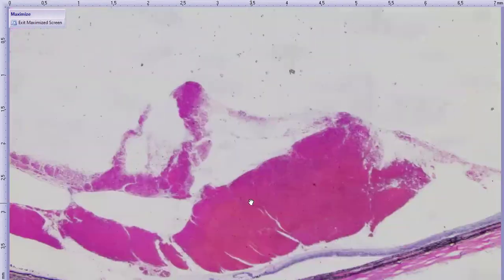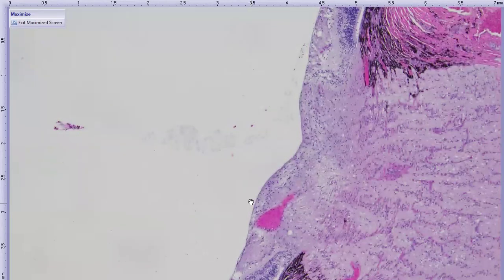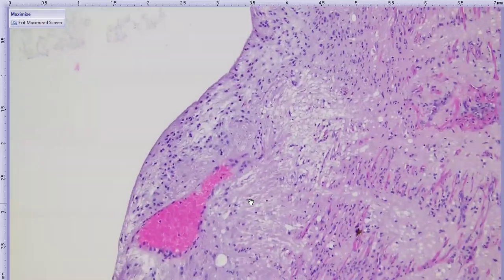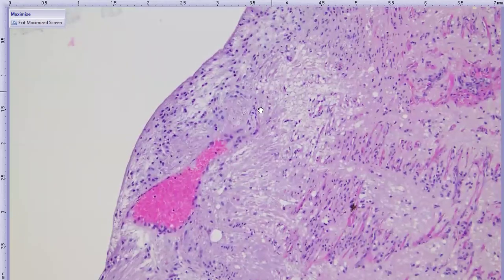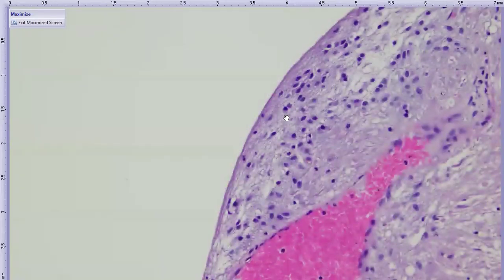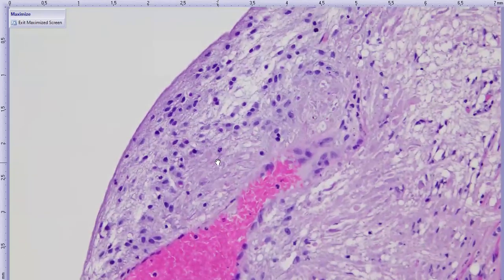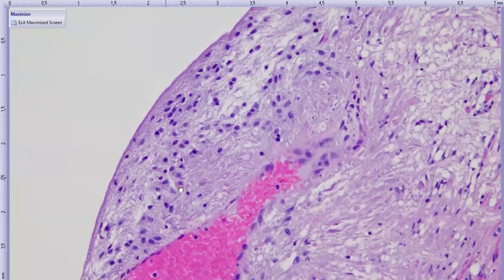And then as we move to the back of the eye, it'll focus. There we go. Inner optic nerve head. There are these areas of increased pallor or rarefaction, and it's really pretty minimal in this case, but there are some neutrophils that are also infiltrating this rarefied optic nerve head, which similarly can also be a feature of acute glaucoma.